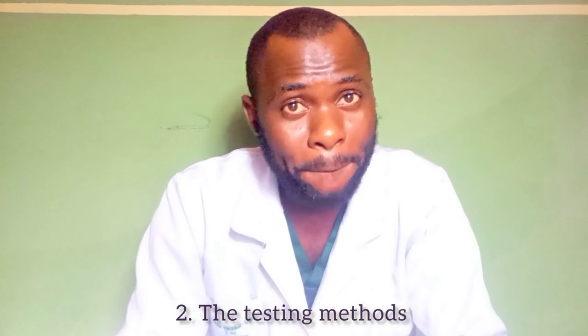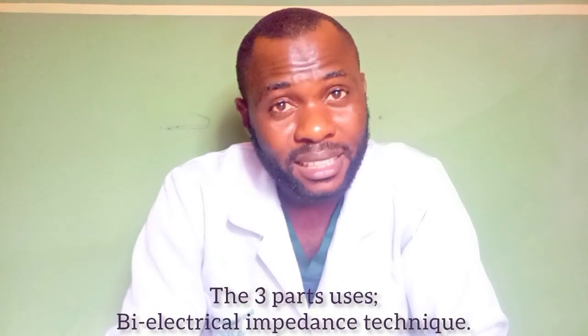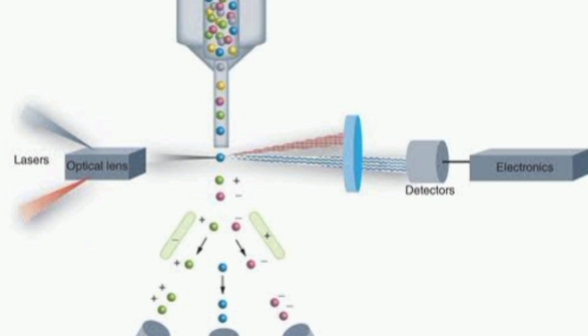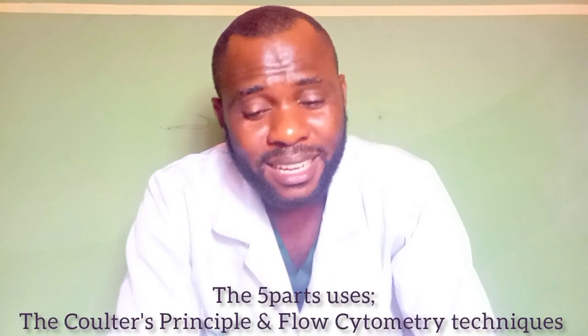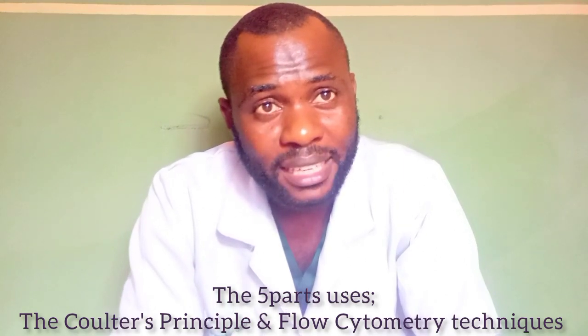And two is their testing methods. The 3-part auto analyzer testing method uses the bioelectrical impedance technique, combined with signal generators, recognizers, and threshold adjusters, counter systems and automatic compensators, using the Coulter principle to find the size and volume of the cells, while the 5-part auto analyzers utilize both the Coulter principle and flow cytometry technique.